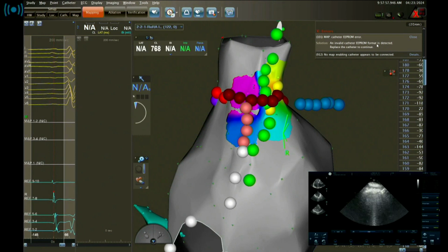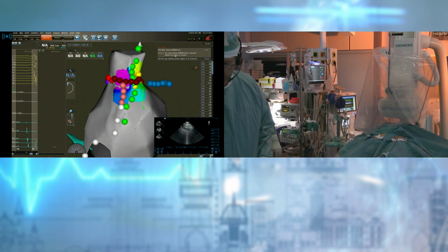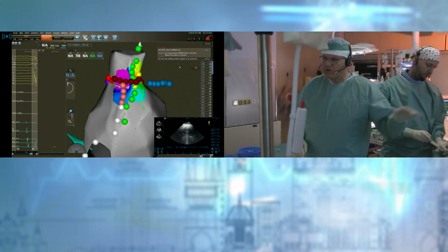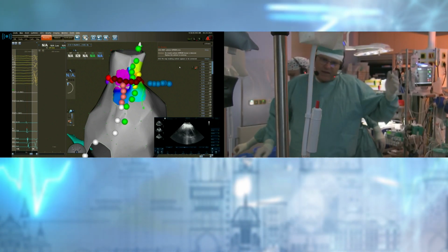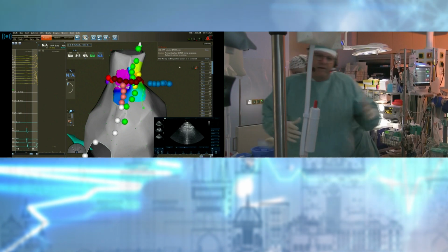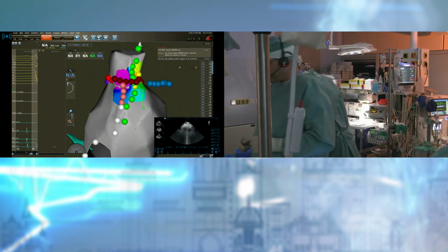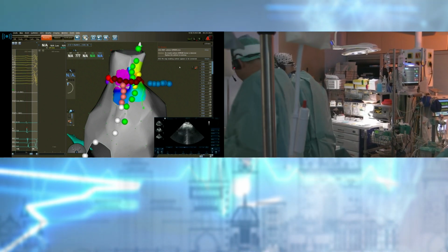But this doubling of ablation lesions, it's completely empirical. No, it's okay. Nobody knows. So you need to take, because normally for PV isolation, the single delivery should be enough. But now we are ablating outside the great veins area, so it's an empirical decision. In VT cases, usually 3 deliveries are done.